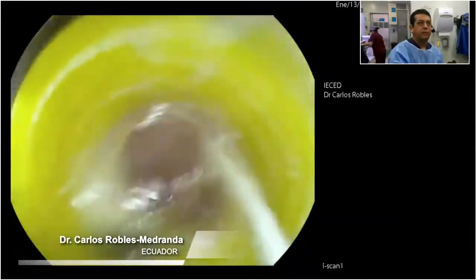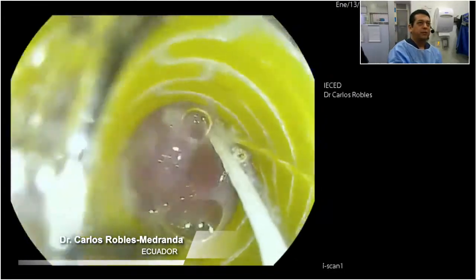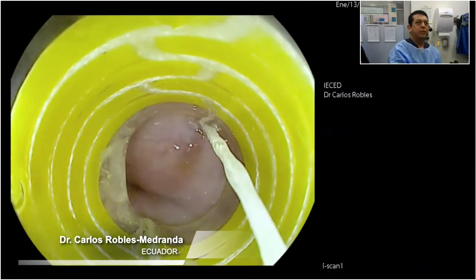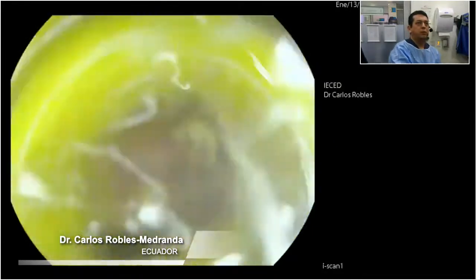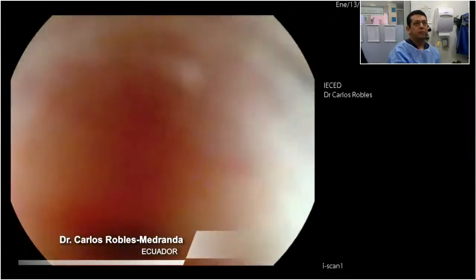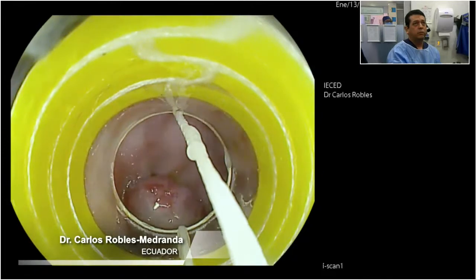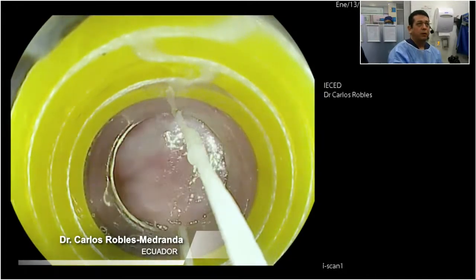So this is a very big test, because we have a patient with bleeding, with red spots, and big esophageal varices, with a history of scars due to previous band ligation. So now we will start here in the cardia. You can see here. It's very important to see exactly where you will start your treatment. Okay. So now I'm here. I will start here. So the aspiration is good. So now the band was delivered. You can feel it. This is good, and you can see very well the rubber attached to the varice. Okay. So now I will do my second shot here.